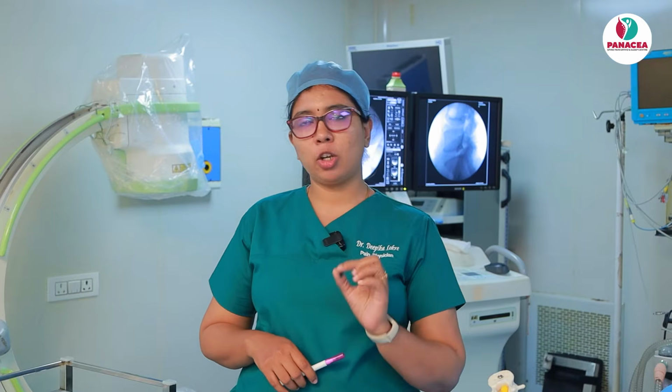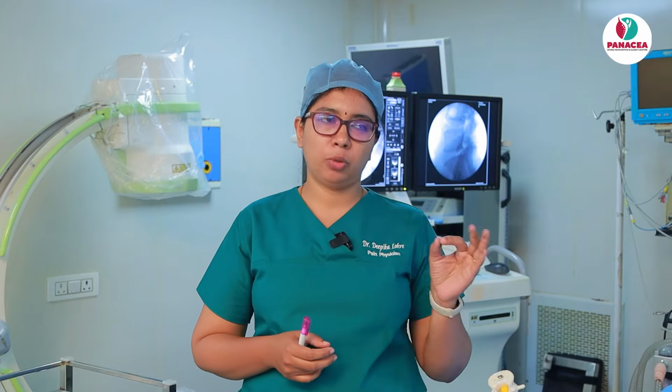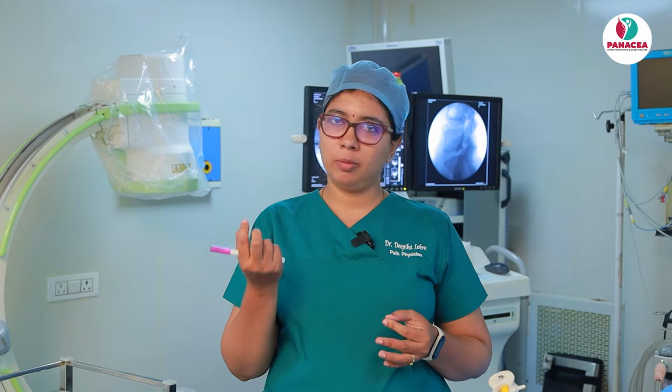It might cause some kind of infection like discitis, if by mistake you have touched the disc and you have not taken enough care to clean with betadine. Take a new needle, and all drugs should be used and immediately discarded. They should not be used again and again with other patients. Because you are working around the spinal cord, we should be very, very careful. Discitis can also happen if the needle goes into the disc by mistake, because the disc is very near, with some bulge there, and we might touch the disc without knowing. When we give the contrast dye, we will realize if it is in the disc, then we will remove it from the disc and only then give the drug.